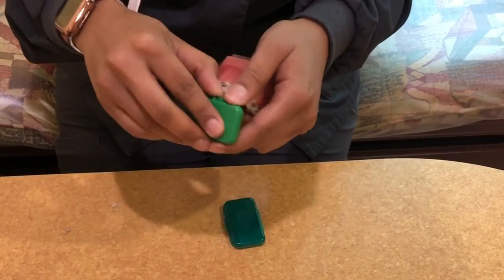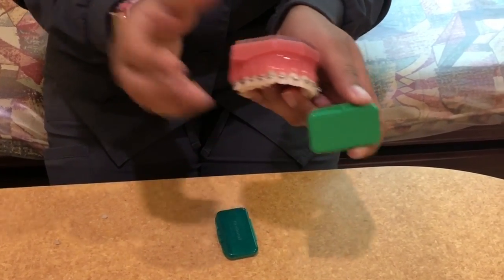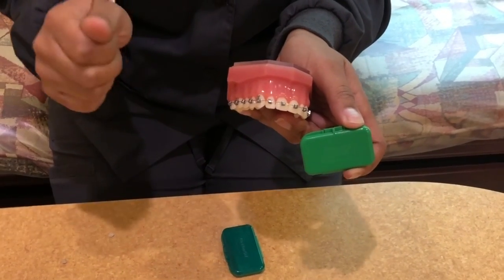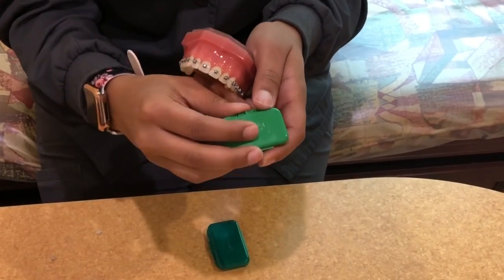You also want to make sure that your braces and your teeth are dry — as dry as possible. You can do this by using a q-tip or a paper towel to dot the area that you're going to put the wax.